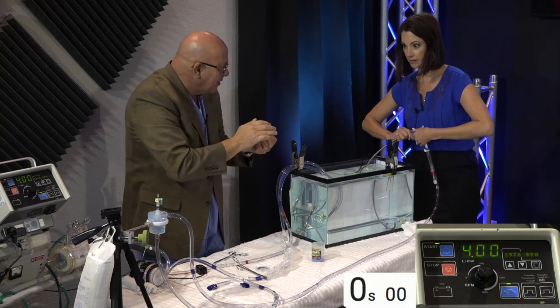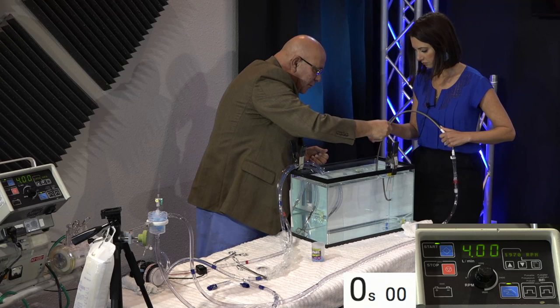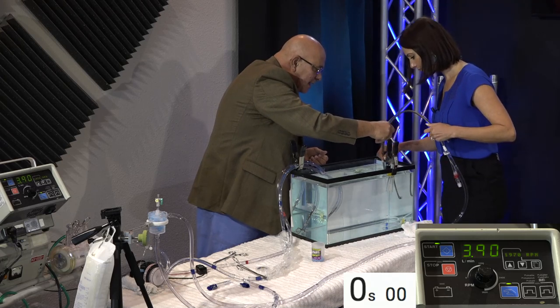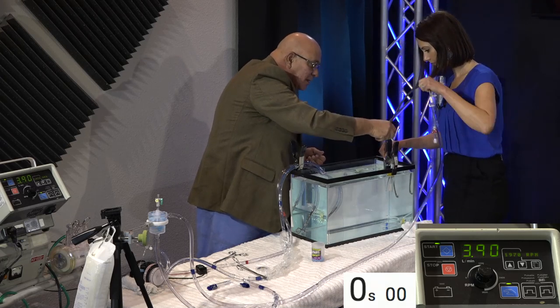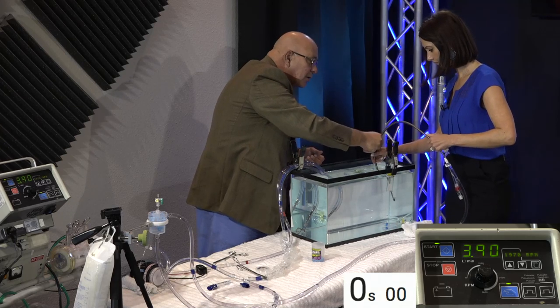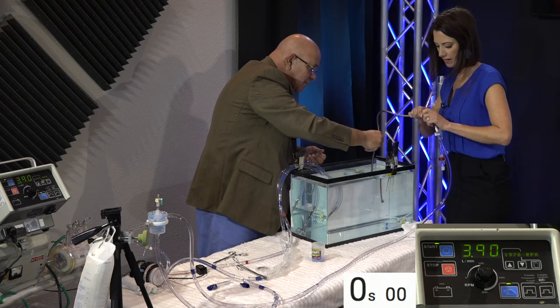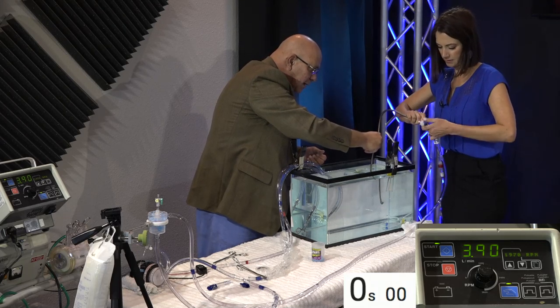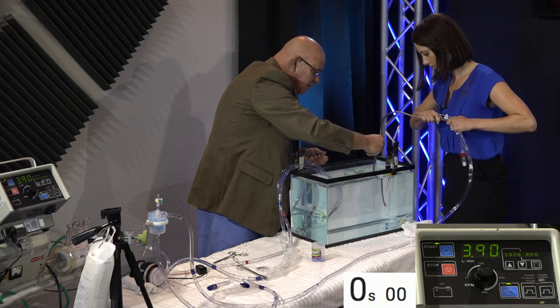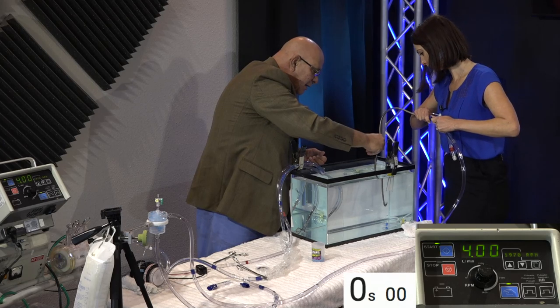And this time, what you're going to do is come stand like this. And when you make that bend, make the full bend, come up with it. Stick the whole thing all the way out. Advance it all the way. Oh, wait. I have to lock it so that we don't get the air. Push it, all the way out. Okay. There. Keep going. There you go.